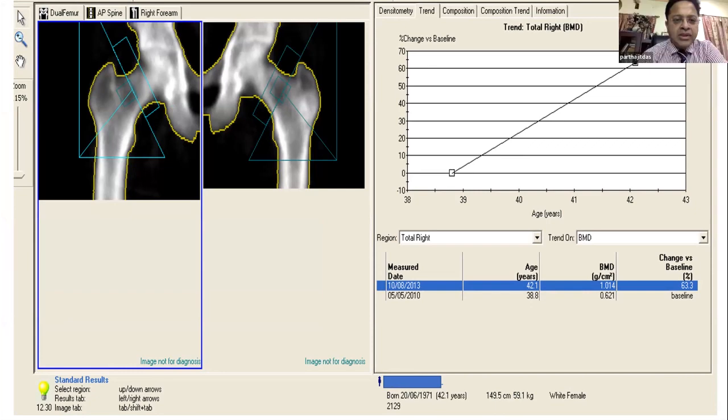Yeah, I think that's right. Dr. Mashru, thank you very much for nicely discussing the pitfalls and limitations of the DXA scan. We shouldn't forget that DXA is a measurement of bone density, which is basically around 50 to 60% of the whole bone strength. We are struggling to measure bone quality; for that you need either QCT or the TBS score. But this is a matter of discussion, and we'll probably discuss it in the next meeting.